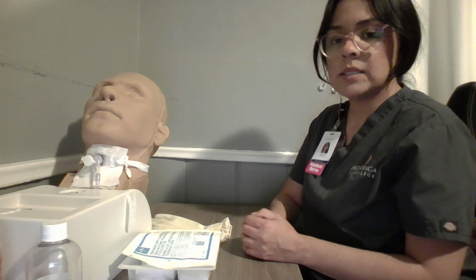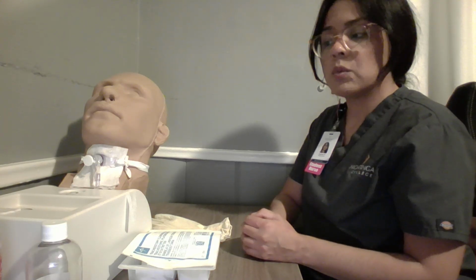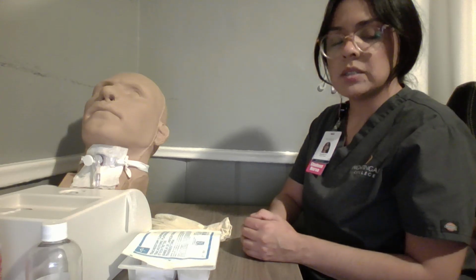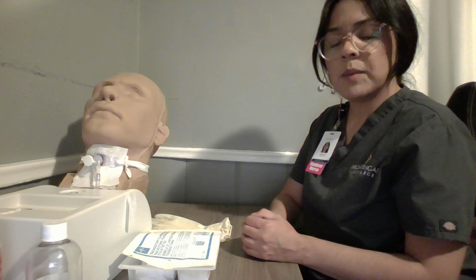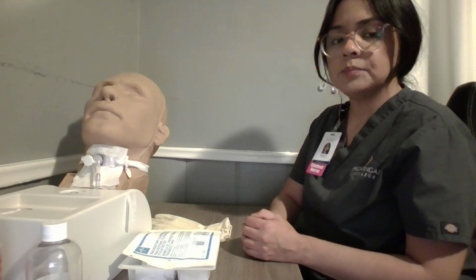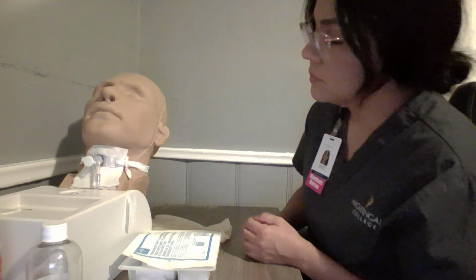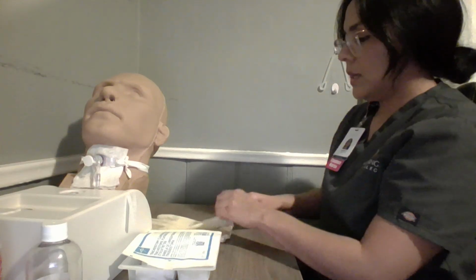I will assist the client into a semi-Fowler or Fowler position, and I will raise the bed to a comfortable height. I will make sure to assess my patient's vital signs, and I will apply an oximeter on my patient. I will suction the tracheostomy tube, and I will pre-oxygenate if needed. I will ask the patient to take a deep breath for me. All right, so I will perform hand hygiene. I will apply clean gloves.